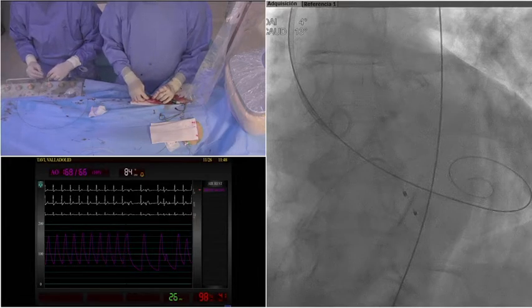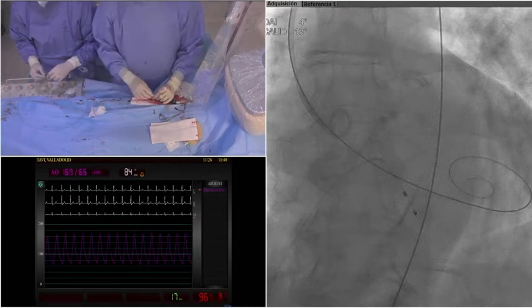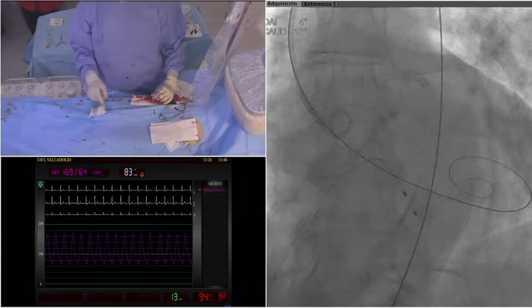Okay, fine. What do you think, Alain, about predilation? Well, actually, I would say that we predilate only in case of severe calcification of the valve. You know, we forget about predilating in the majority of patients.